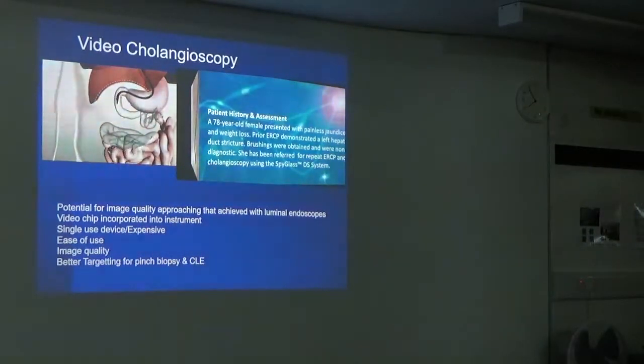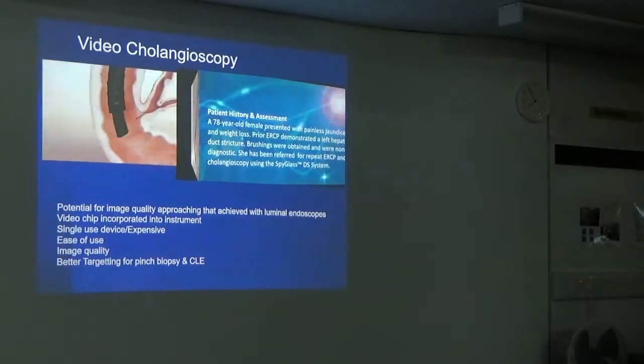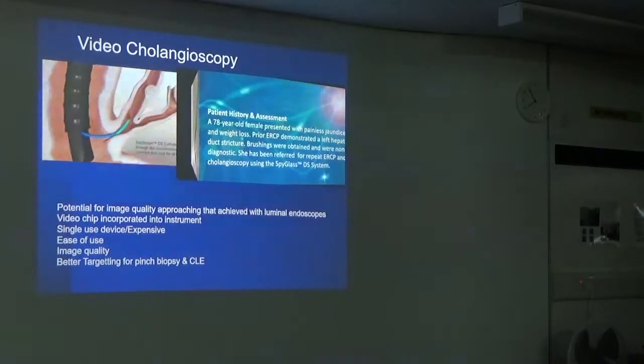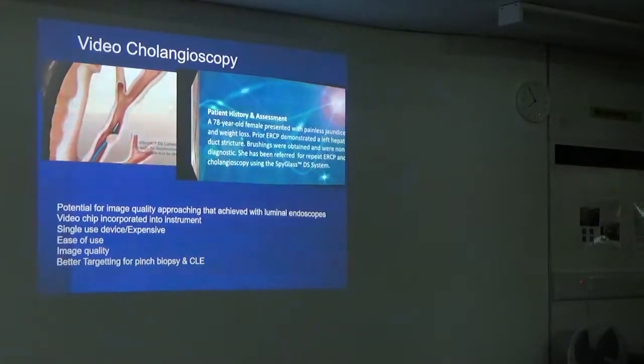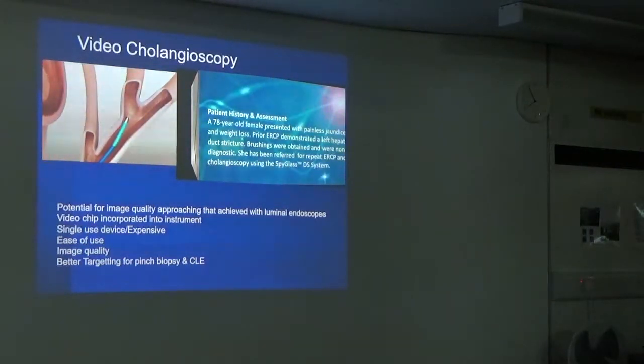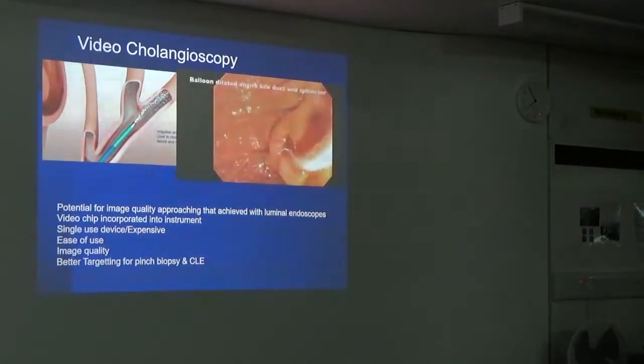Can I ask you a question? Has it got a light source on the... It does, yes, it doesn't show, but it's on the end of it, it's got two light sources, as well as the video chip, and then a channel for irrigation, and you can control it up or down. As you can see, it shows it moving, and it's literally just 3-4 millimeters diameter, and that's just showing some irrigation.